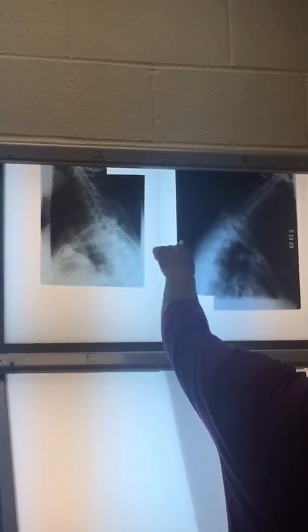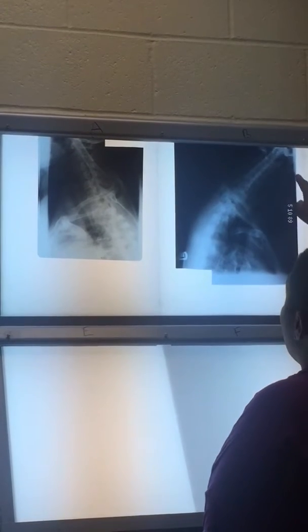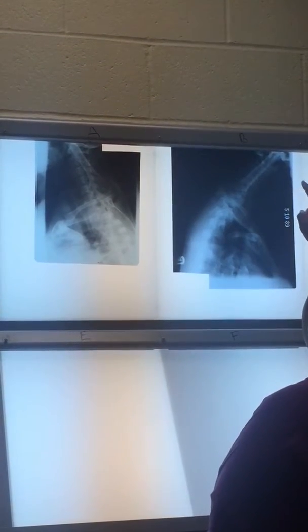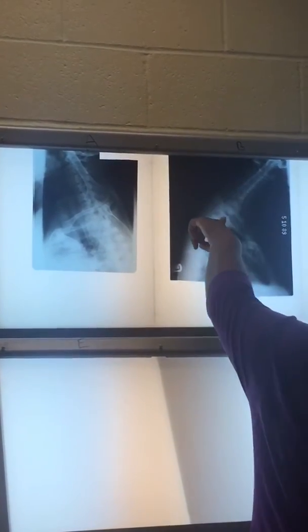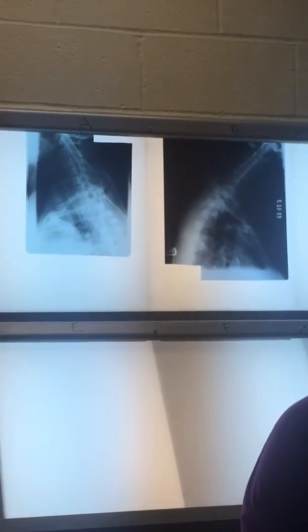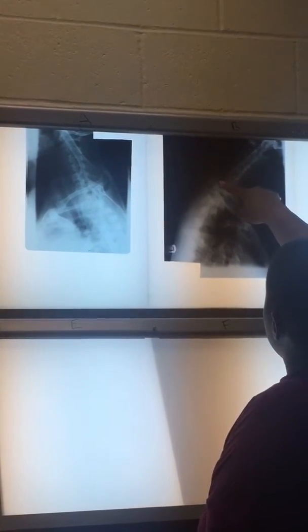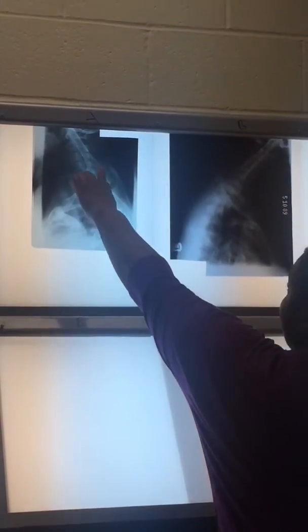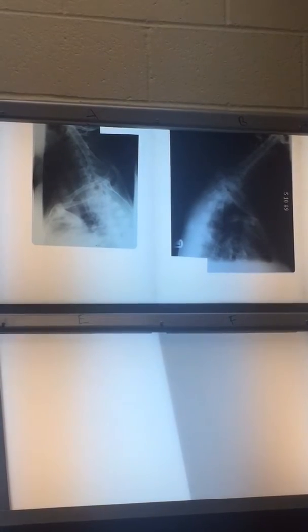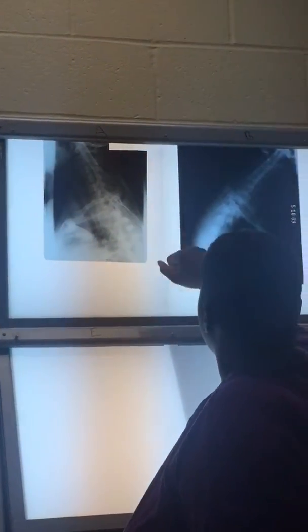You may have a little strip going down — that's going to be your scapula. It's going to come across the vertebrae on the thoracic spine. You can also see the airway, the hyoid bone, and spinous processes, so you can still identify what vertebra is what. On the X-ray you can see the humeral head here, and the humerus going up. You also get the zygapophyseal joints and the scapula.